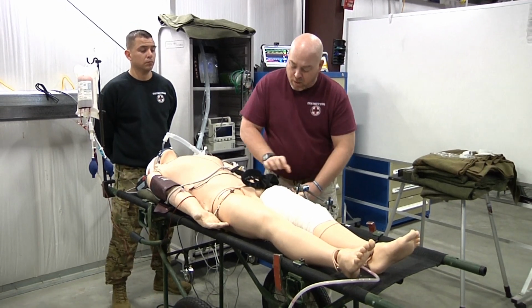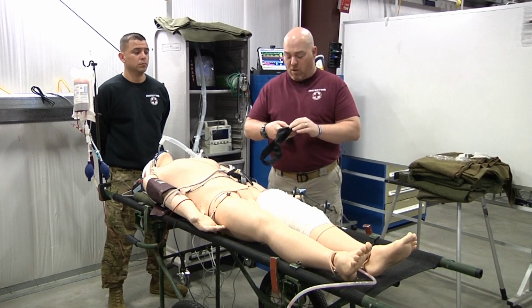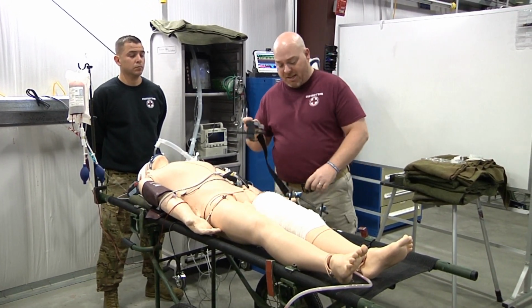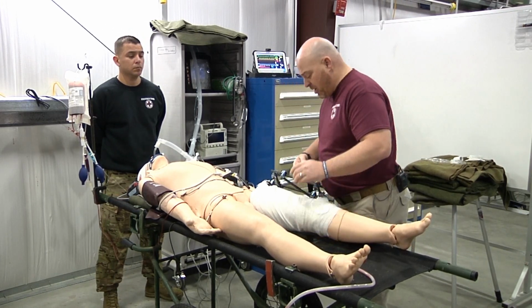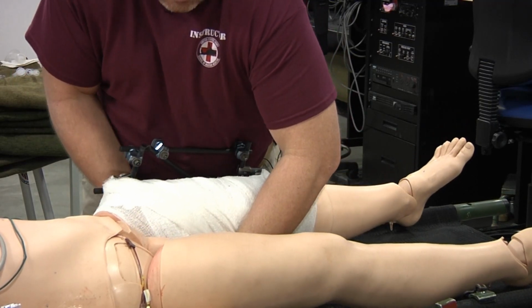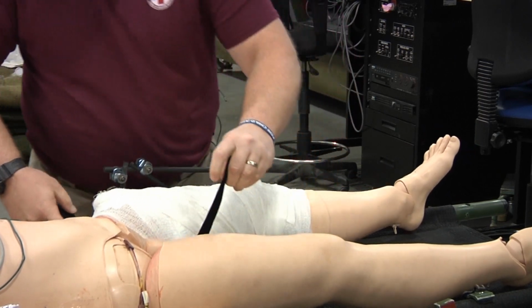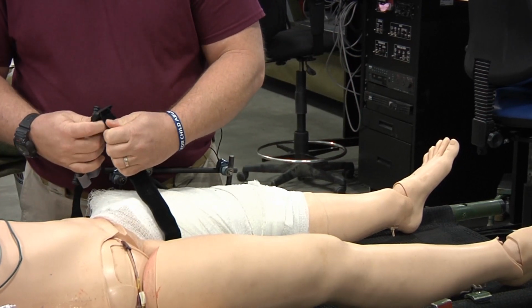Other things that you can do if you're worried about extremity injuries, maybe you have an amputation or multiple amputations, or if you have entrance or exit wounds in the extremities, you can place tourniquets where those injuries are as well. Now this patient has an external fixation device, and most likely it will not bleed in flight because it's already been surgically repaired. But if it was an amputation, like I said, or something like that, and you were worried about it bleeding or starting to rebleed in the aircraft, then you would want to place prophylactic tourniquets there as well.